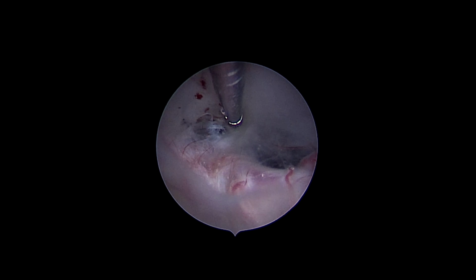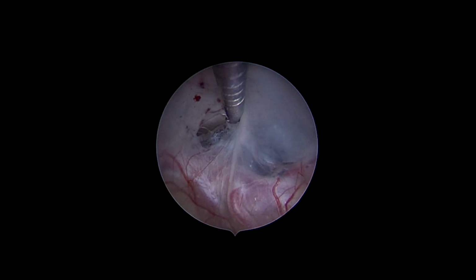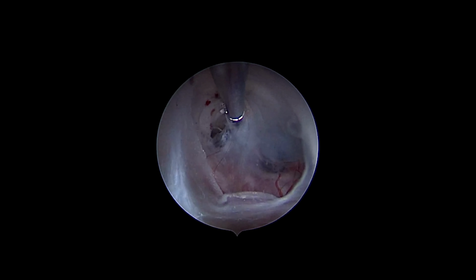We decided to make another hole on the floor to make the stoma bigger.